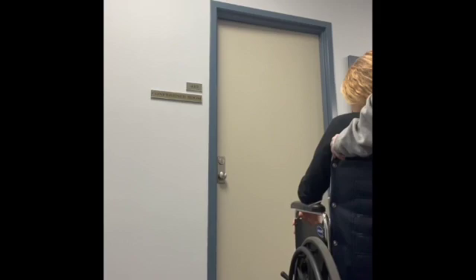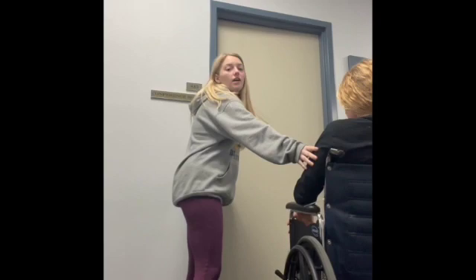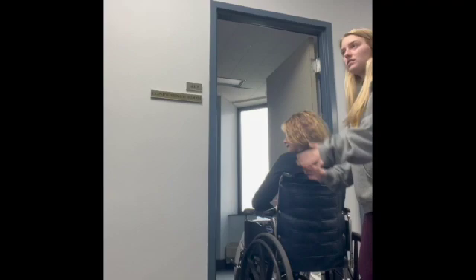When taking a patient through a door, inform the patient first. Open the door while maintaining a hold of the wheelchair. Make sure the patient's hands are in their lap so they don't get caught, then push them through the doorway and close the door behind you.